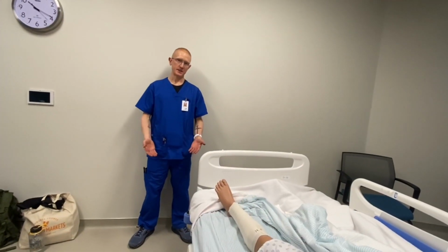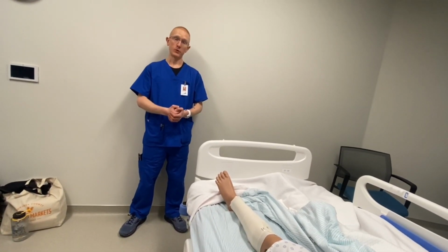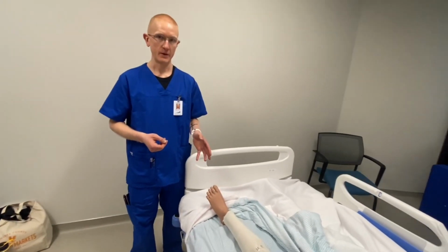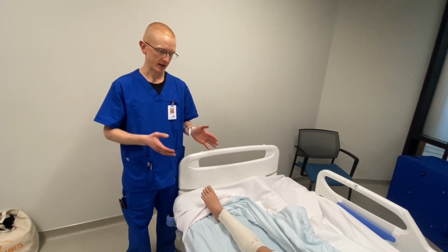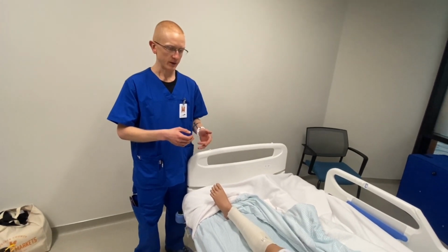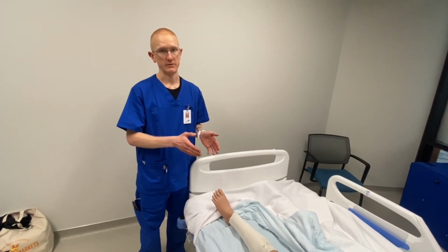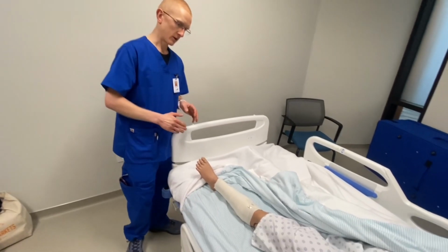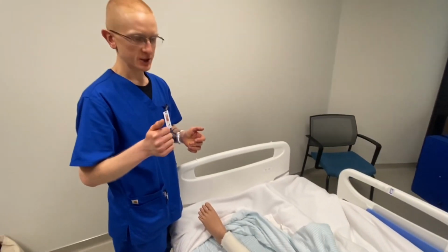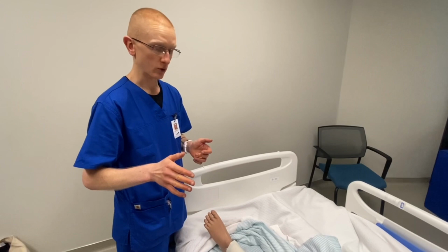So the ACE bandage is another form of compression device that we can use, and before we would apply it, we would of course do all of our assessments of the lower limb. It is used for edema as well as with the TED hose, and which device you're choosing depends on the doctor's orders and patient preference. So we would do our skin assessment first, assessing for abrasions, open wounds, edema, rashes, any sort of bruises or sores.